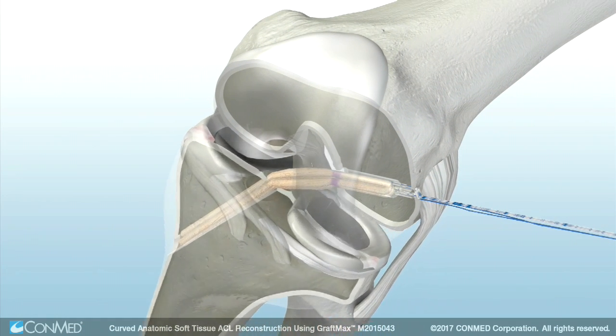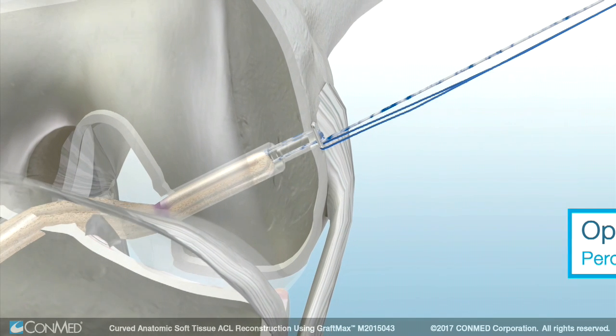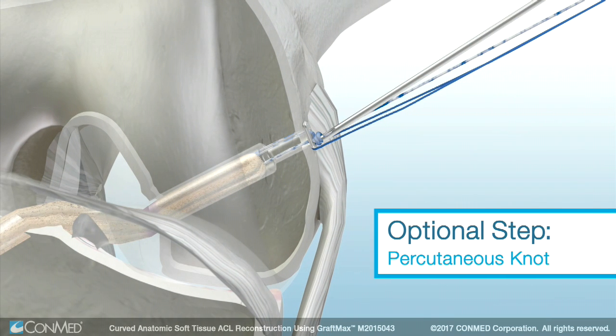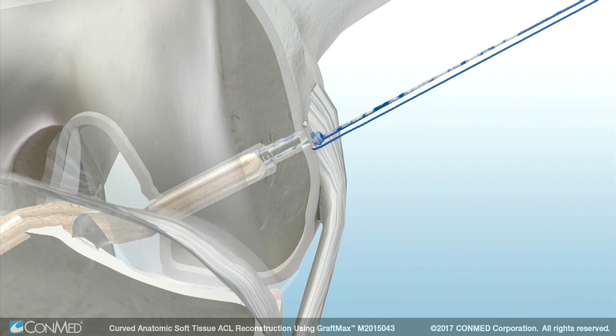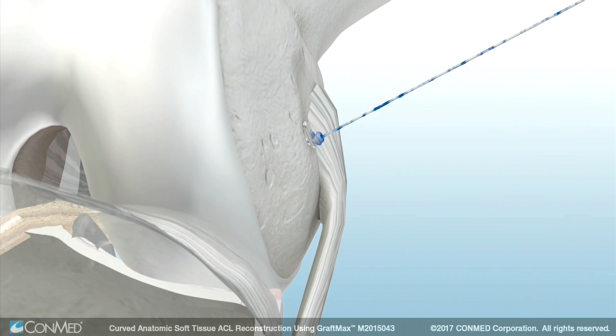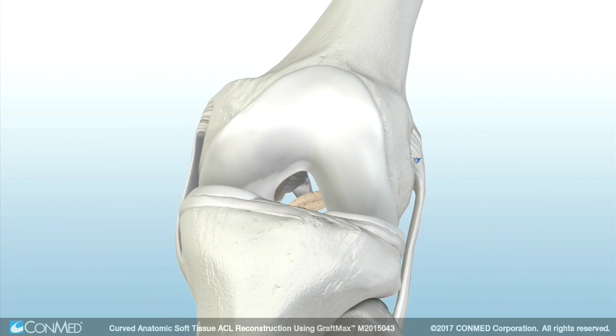Then set the knee at the desired flexion angle. Insert the Genesis matrix interference screw in the center of the graft bundles and advance it into the tibial tunnel until flush. An arthroscopic knot pusher can be used to percutaneously tie a knot in the striped sutures over the top of the button. Next, unthread the blue suture from the button. Trim the two strands of the striped adjustable loop tails flush to the skin with a sharp blade.